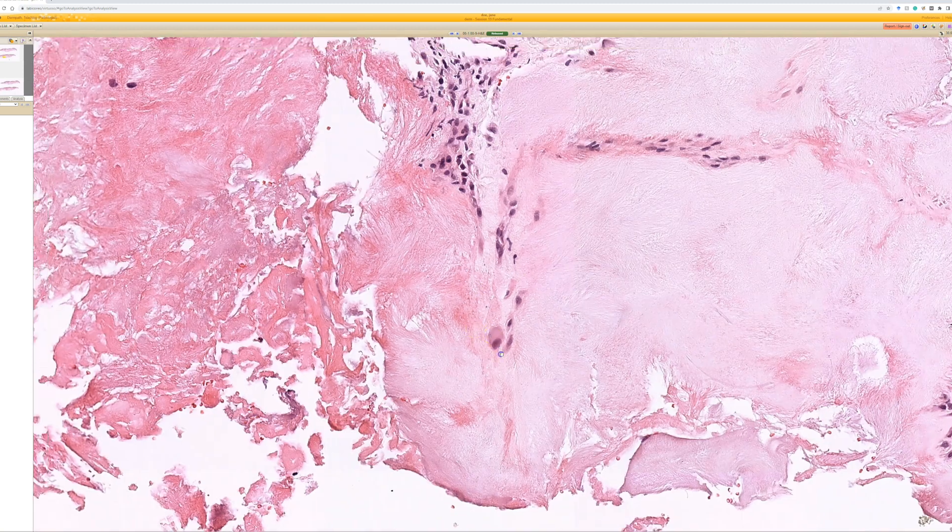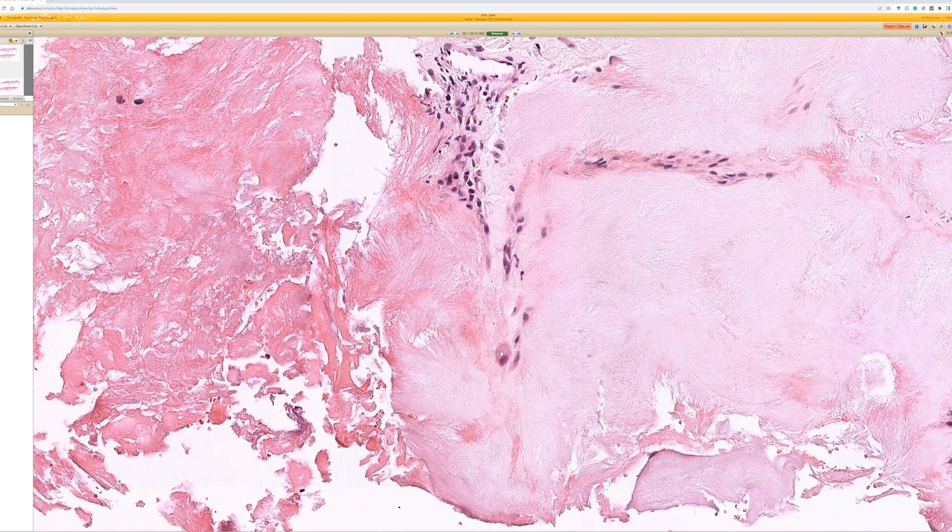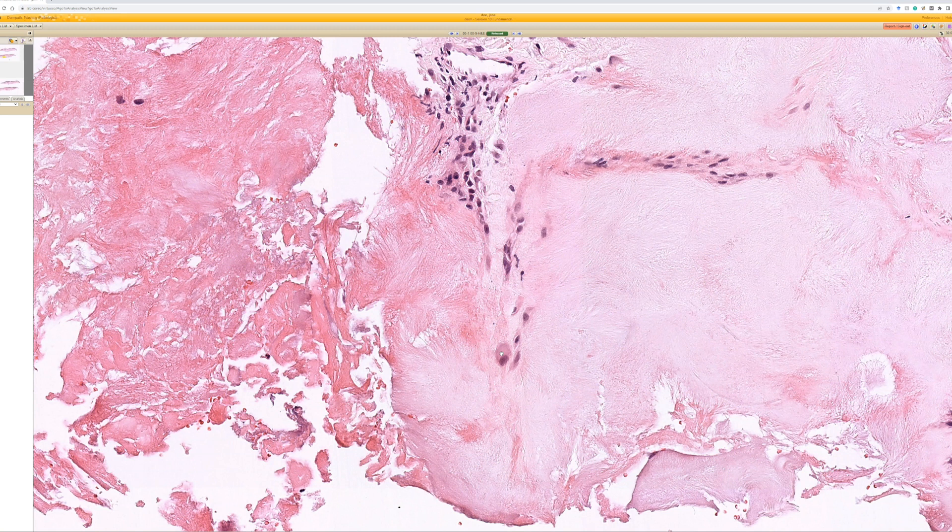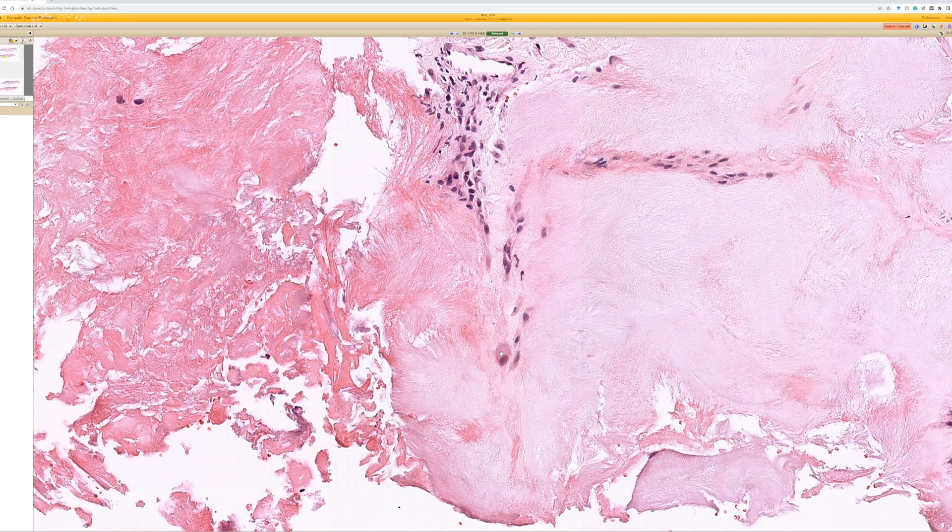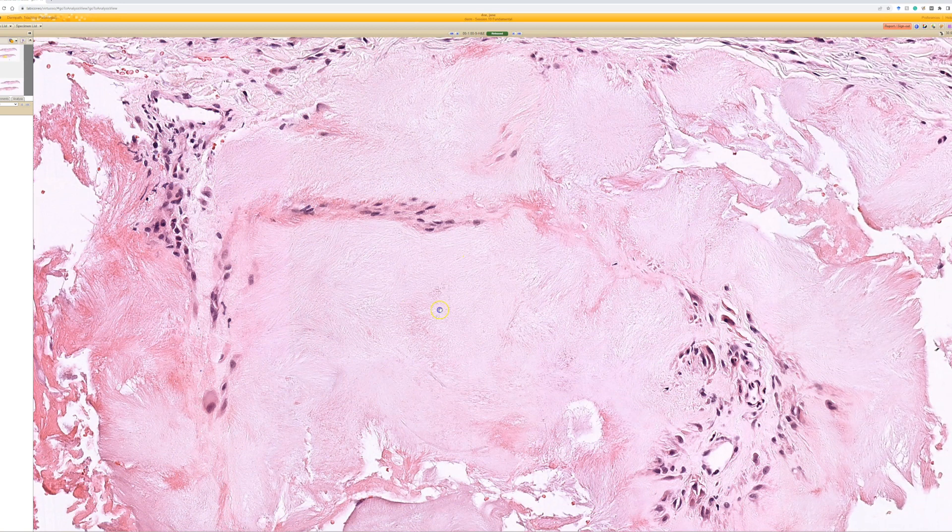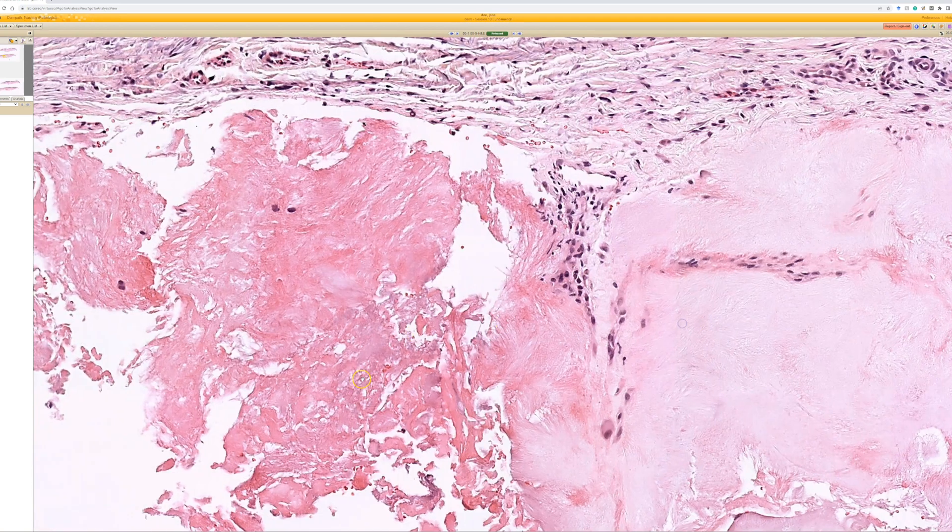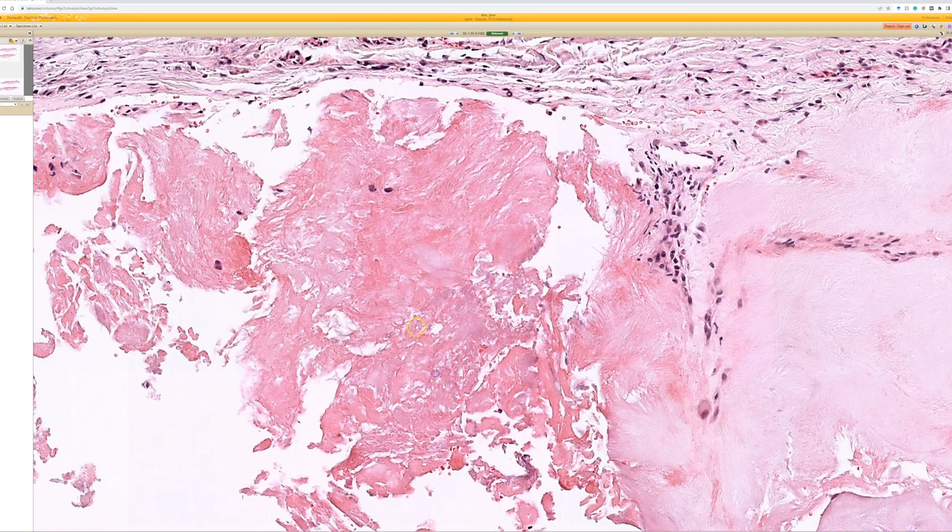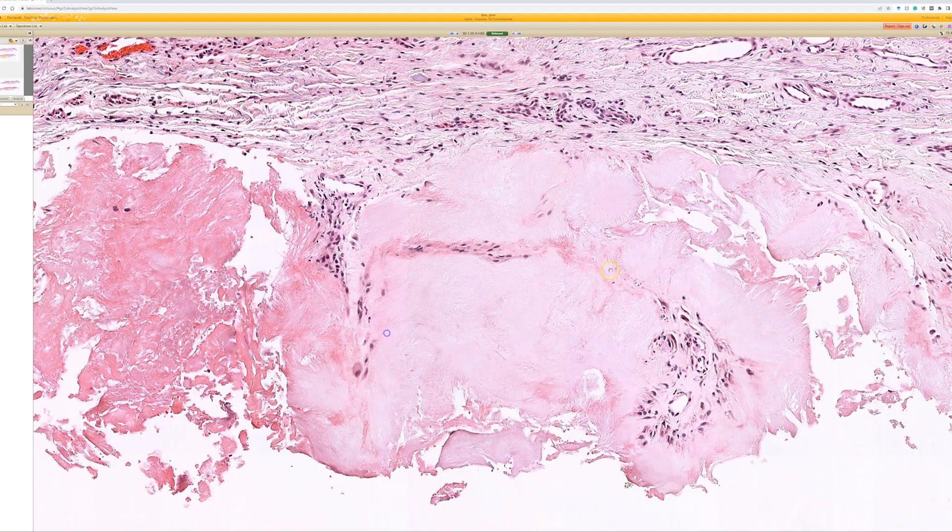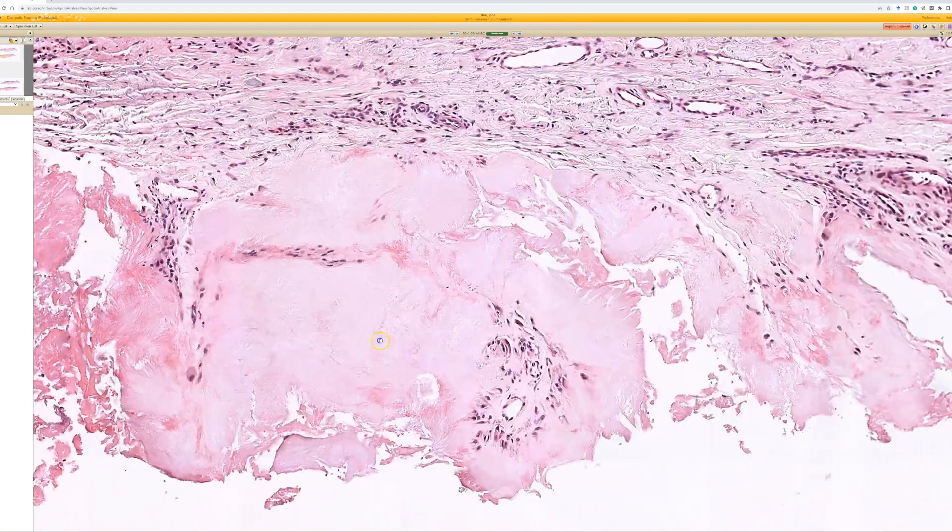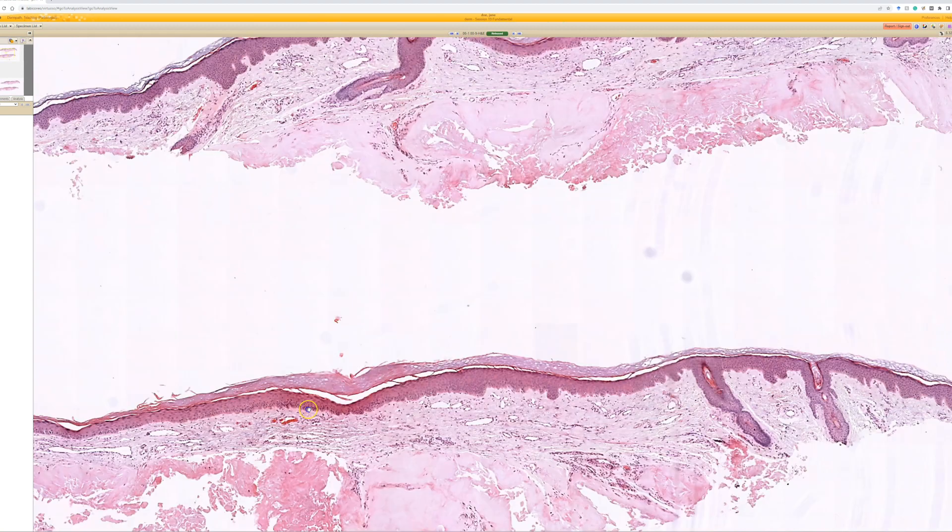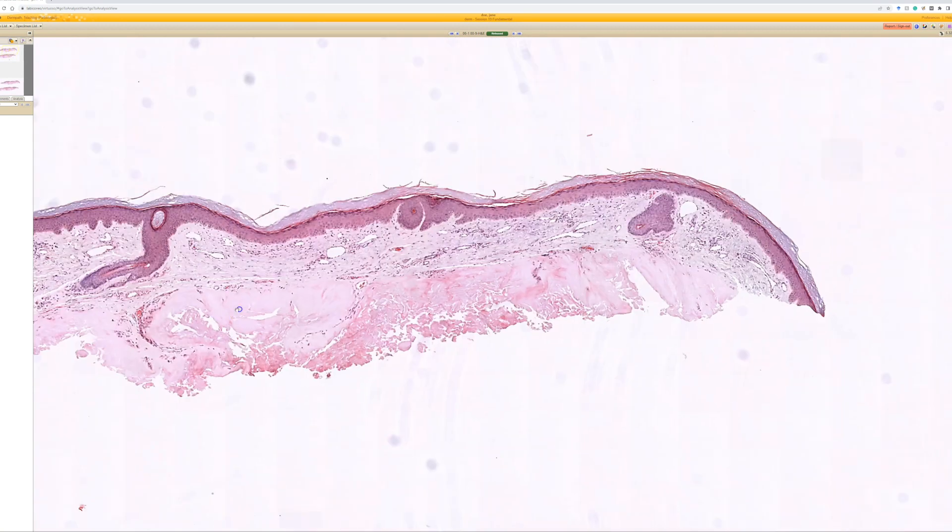Sometimes you can cut an unstained slide and have the laboratory heat it to remove the paraffin and then don't stain it. Just look at it with the paraffin melted down or dissolved, but no stain done. And sometimes you can get some of the crystals to polarize actually, but I rarely ever need to do that because this is gout, right? Like nothing else looks like this to me. So in any case, here it's got a darker pink color, but it usually looks this very pale pink. So that's a great example again of gout.